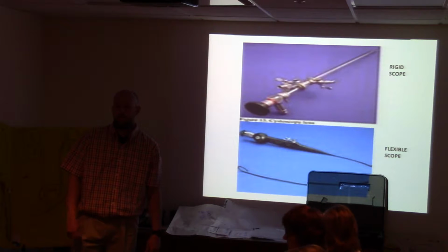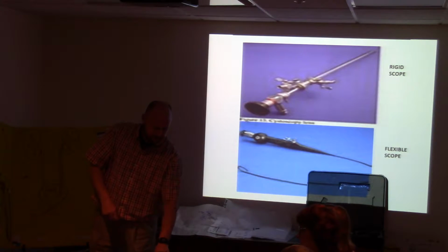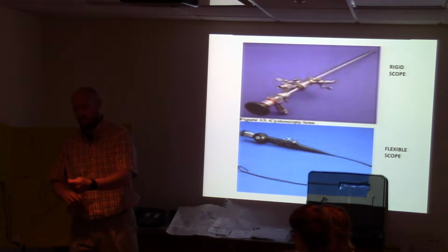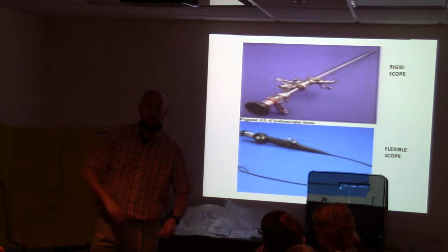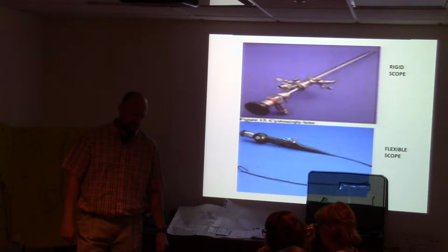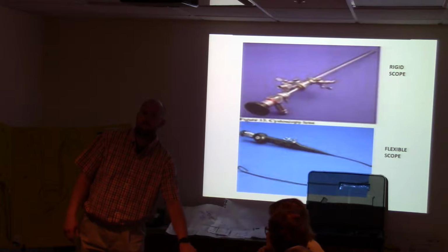If it's just a stent removal, some guys, like during a lithotripsy with a couple hundred shocks to go, they'll stick a flexible in, find the end of the stent, and use graspers, which have little grabbers on there, and they'll just grab the stent and pull it out, and then we're done all at once. Instead of pulling the patient down, putting them in stirrups, it just saves a lot of time. And some physicians are more skilled than others. So with flexible, you don't have to really get them with their legs up? No, with flexible you really don't have to.